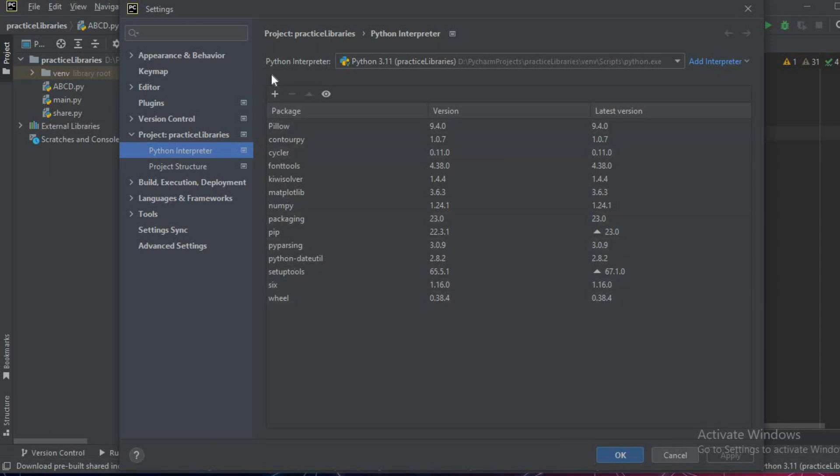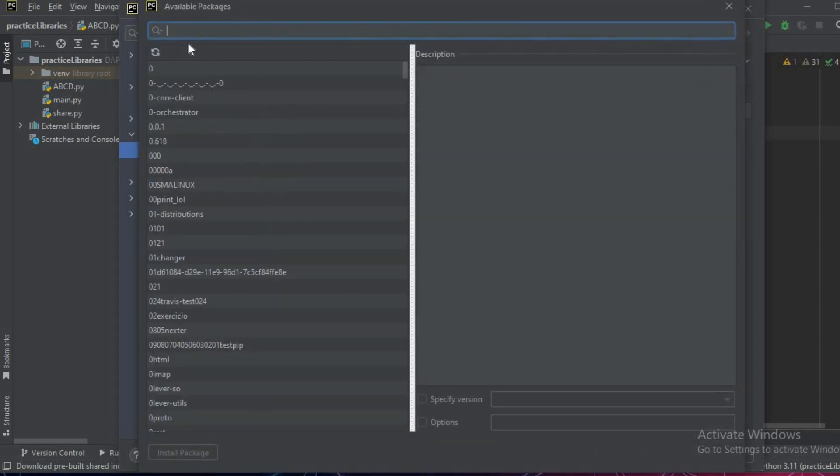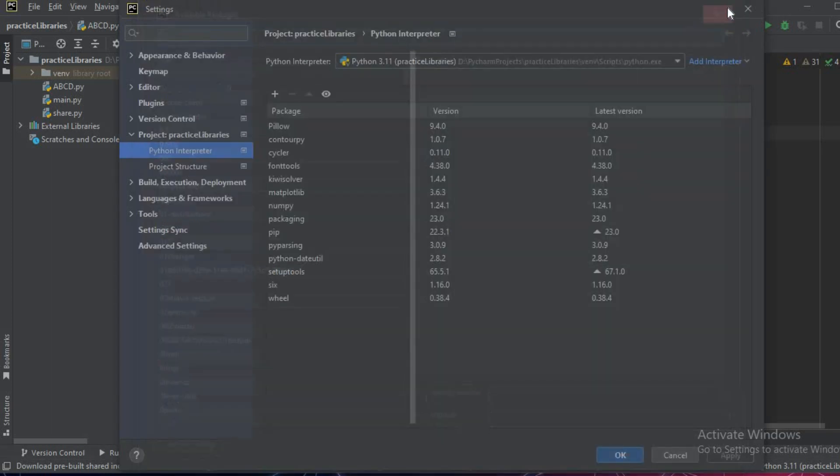If you do not have these libraries, you can use the File Settings and then you can see the packages. You can add the packages from the plus symbol that you can see.